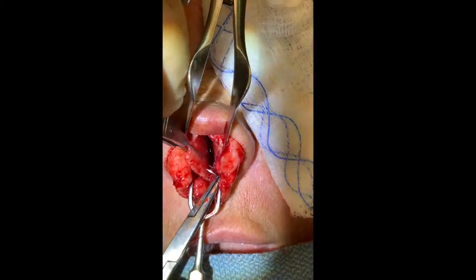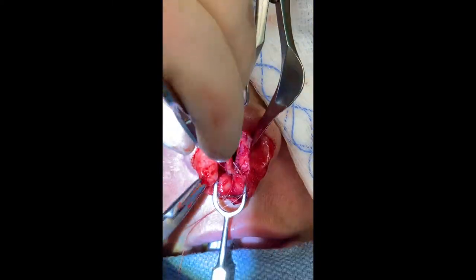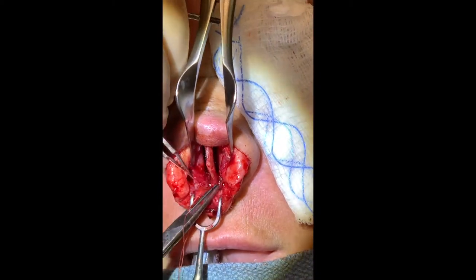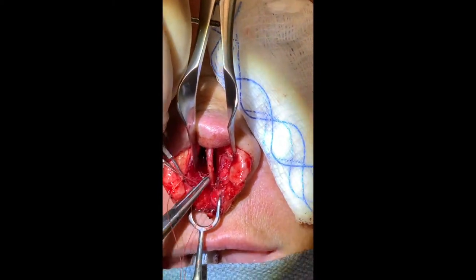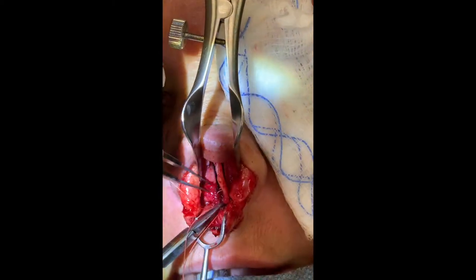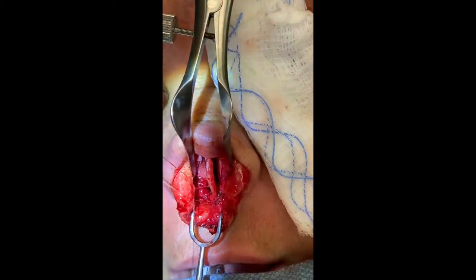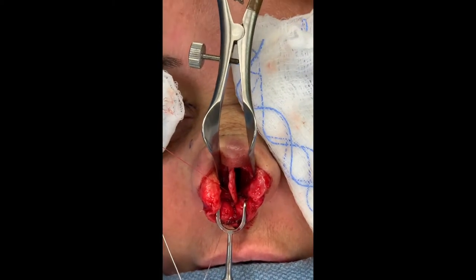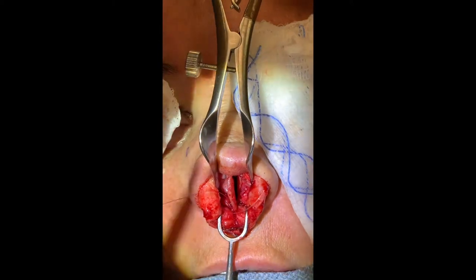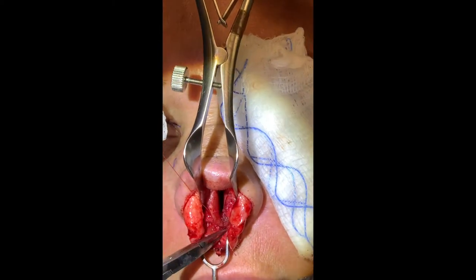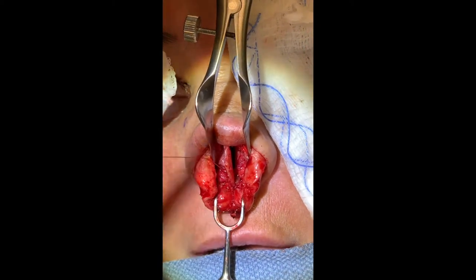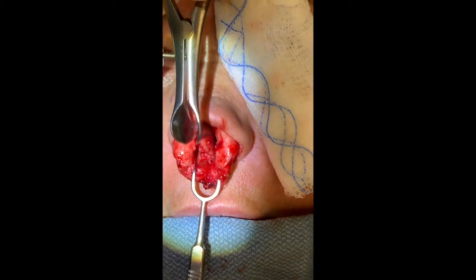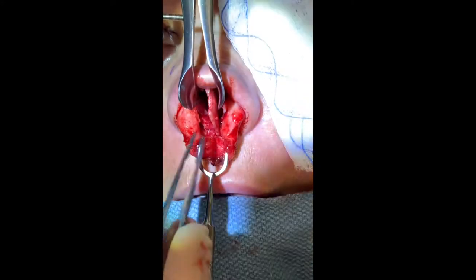Going back through the cartilage at this point on the deep soft tissue at the nasal floor, tying the suture down. And finally, assessing the stability of the repositioned, now midline, caudal septum.